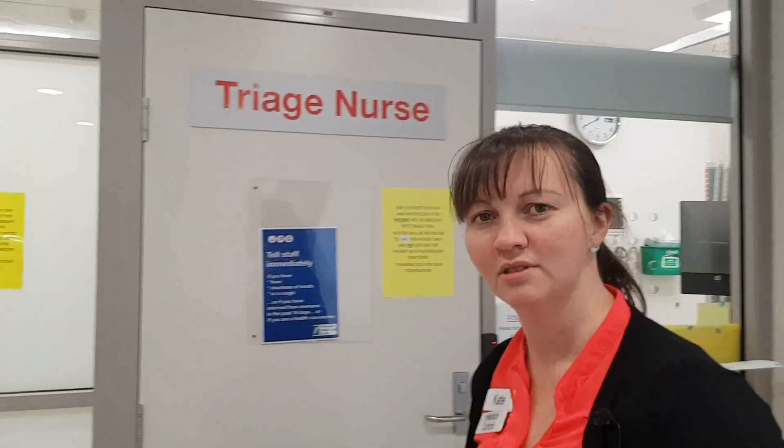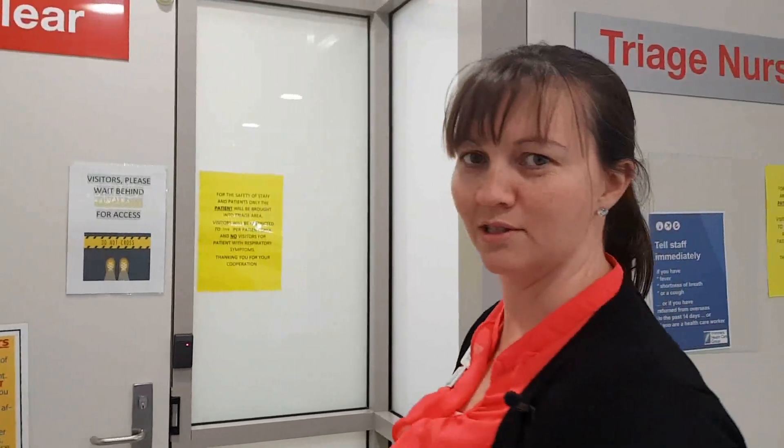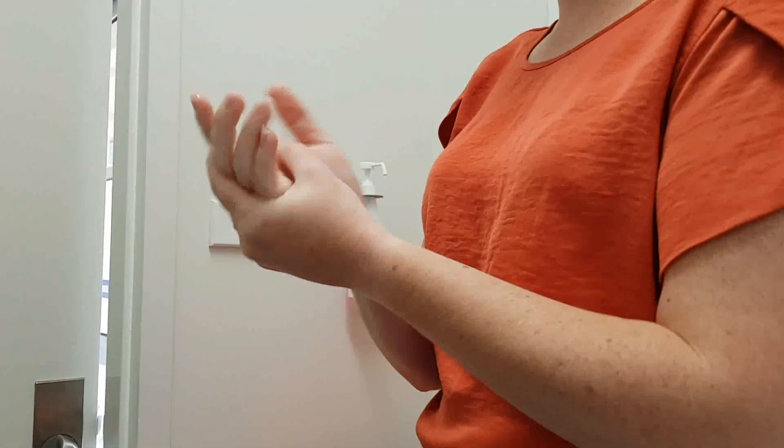When applying and removing airborne PPE, it's really important to attend the correct sequencing to prevent contamination of your hands and your face. It's also really important to make sure you attend your fit check of your N95 mask before you enter the room. Always start with hand hygiene to prevent contamination of your clean PPE.